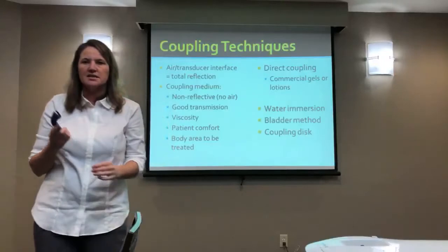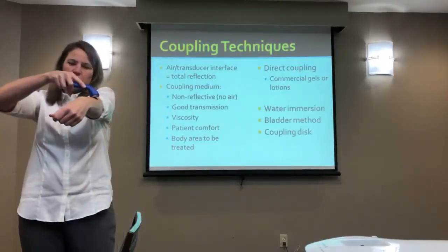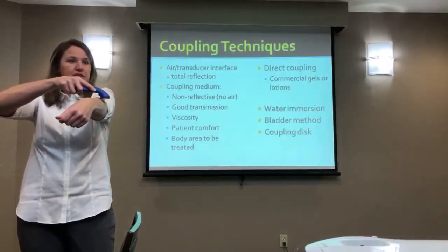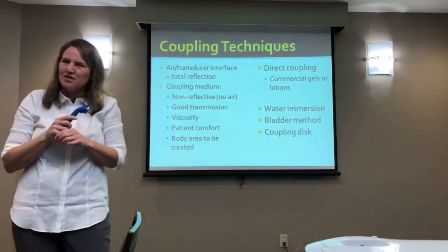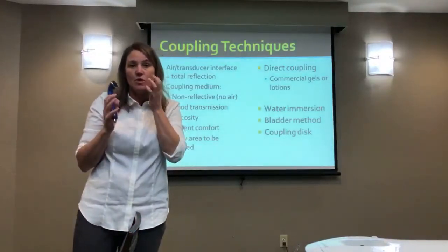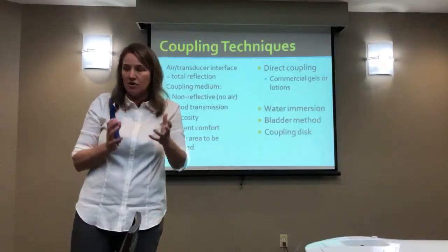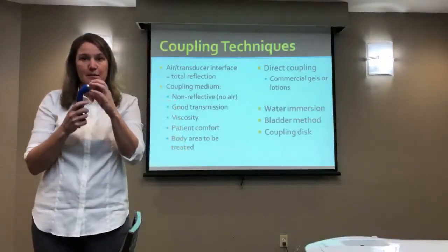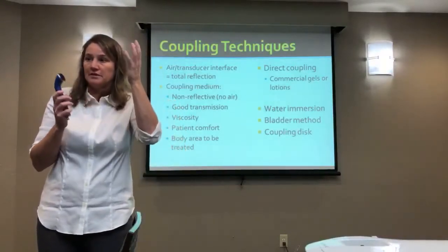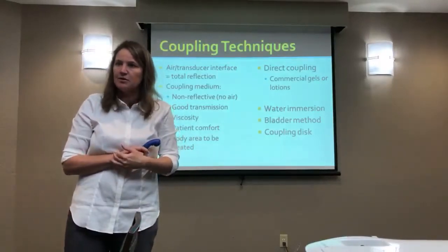A common mistake I see too is people going back and forth and letting air in, if you go back and forth and the air's going in every single time. So some of it's more your technique that could cause your machine to beep at you. Because sometimes what will happen is a lot of machines, they'll beep if it senses a lack of contact. And that's usually because the temperature of the ultrasound head starts going up and it beeps, beeps, beeps. If that's happening, look at what you're doing and see if maybe you're not coupling properly or effectively.